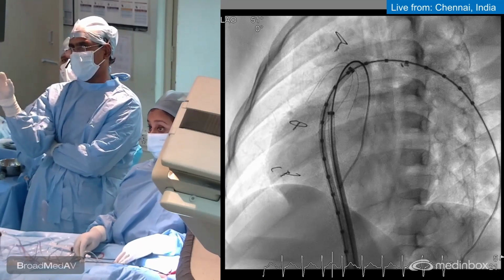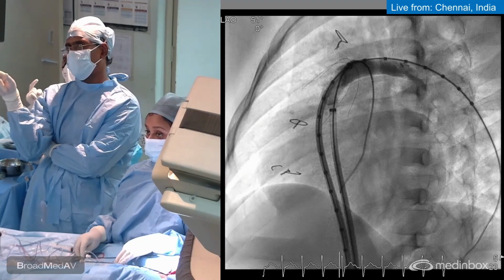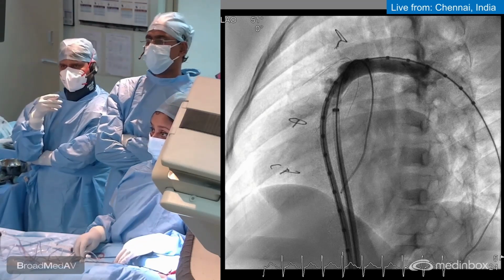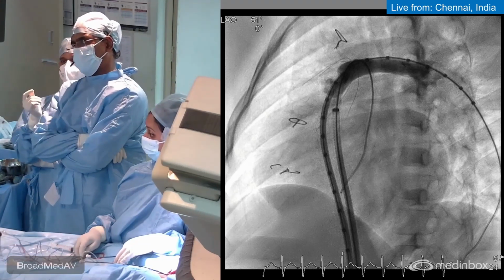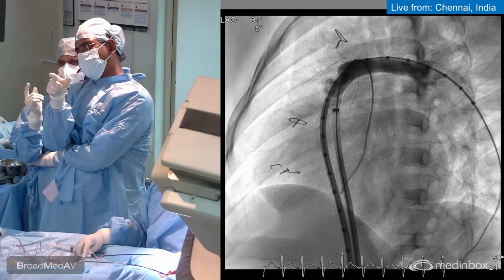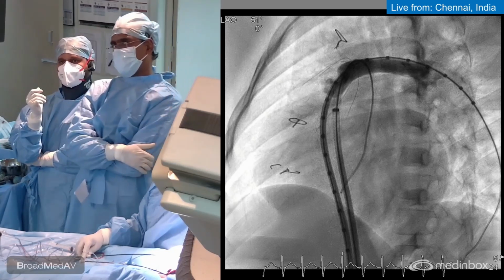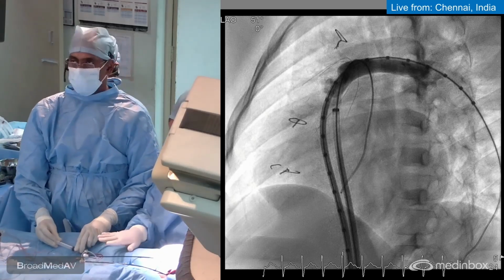Just empty the contrast. Let us see the number of holes. Yeah. Now you start going onward. Okay. Next frame. Enough. So here it's 1, 2, 3. Yeah, definitely. It looks like almost 4. We have to capture that LPA origin as well. The LPA origin is now in this frame exactly below the first sternal wire and above the sheath tip. Can you see that? Yes, sir. So from that point onwards, we have to capture it.